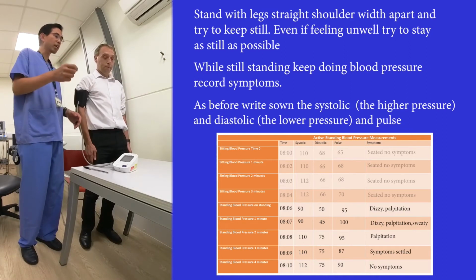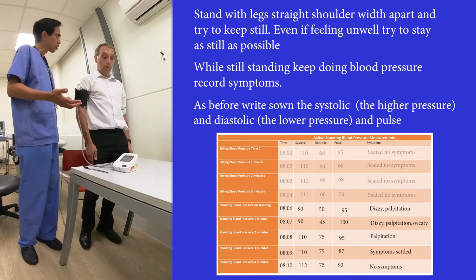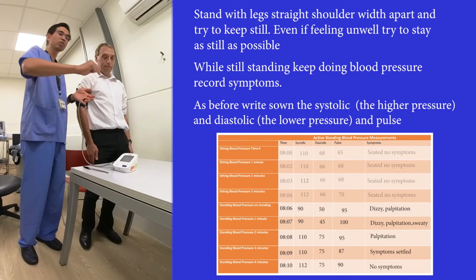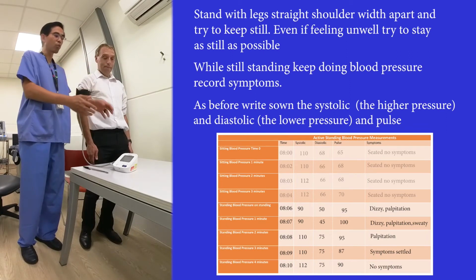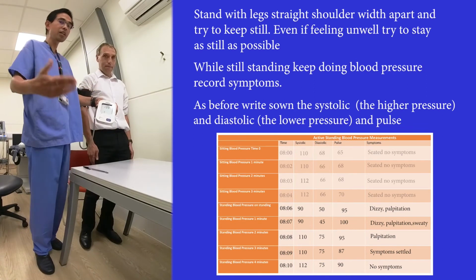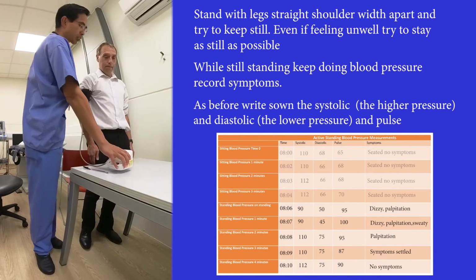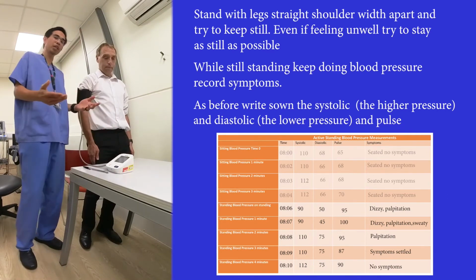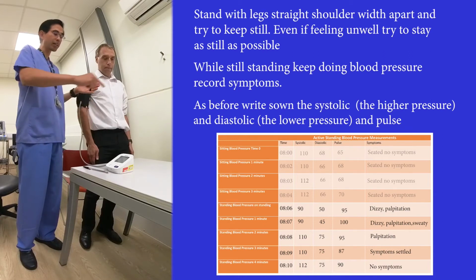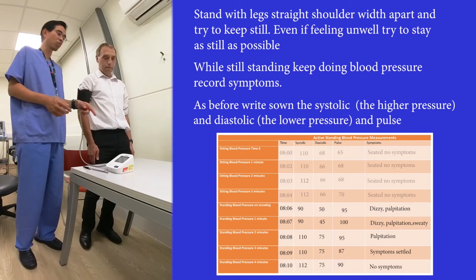He's going to say to the person helping him, are you feeling anything, Phil, at the moment? No. So we're going to say standing minute 1, no symptoms. We're going to wait for this device to record the blood pressure. You can see it typically takes 45 seconds or so, depending on the machine, to come to a stable value. What we will do is record in the standing row the value of the blood pressure. This is minute 1.